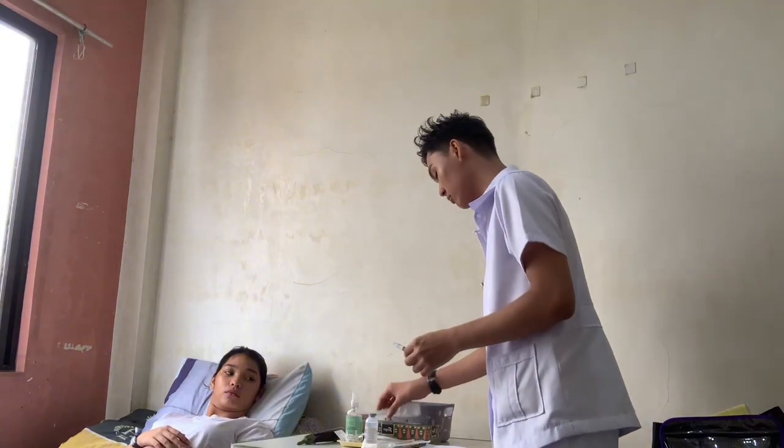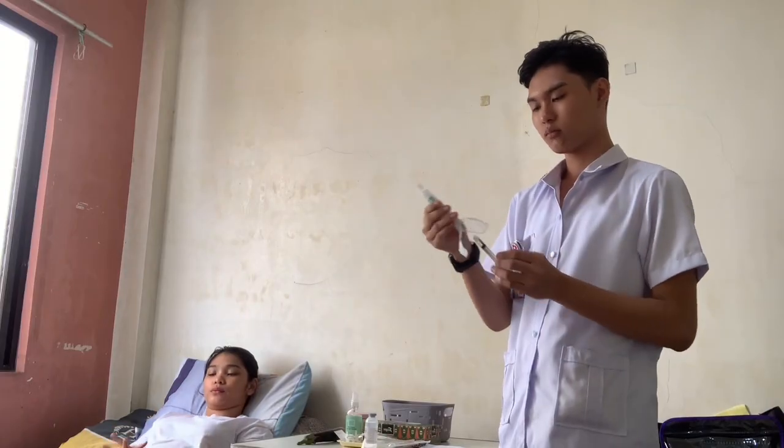But before doing that, I will remove the aspirating needle. And I will discard it into the waste receptacle. And I will change it with the right size needle.